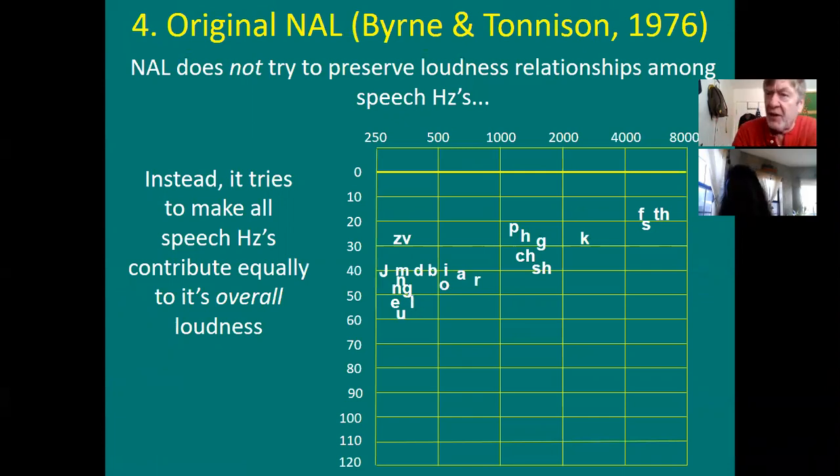Well, NAL said, we don't care. That may be the way normal hearing people hear speech. Frankly, my dear, I don't give a damn. Because when we amplify, we're going to make all of these speech sounds equally loud. We're not going to preserve this loudness relationship among speech frequencies.